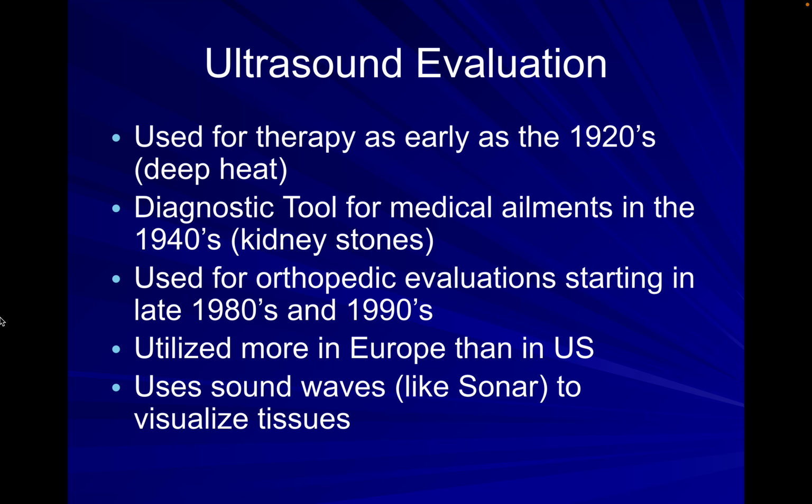For ultrasound, it was often used as a treatment in the early 1900s and then started to have more diagnostic applications into the 1940s, and then in more recent times has developed application in the orthopedic setting, particularly now in 2023, as we are having more access to point of care ultrasound with portable ultrasound units.